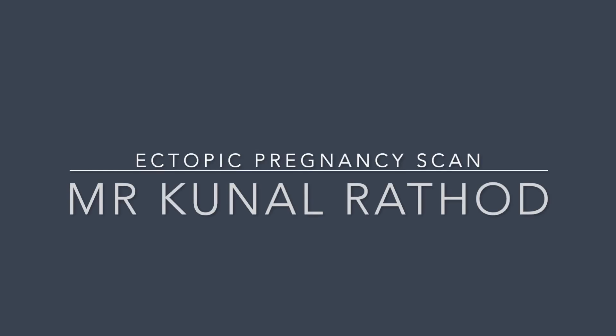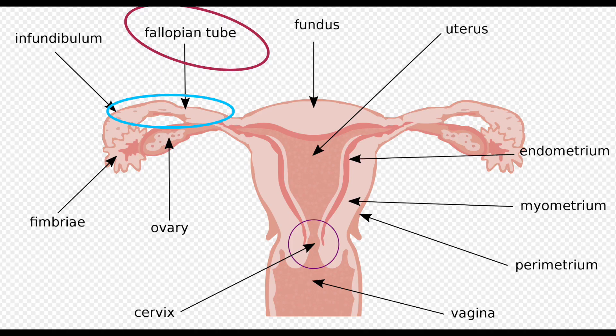This is a video demonstrating ultrasound scan for an ectopic pregnancy. This is the anatomy of the uterus, tubes, and ovaries. The one marked in the blue circle is the fallopian tube.